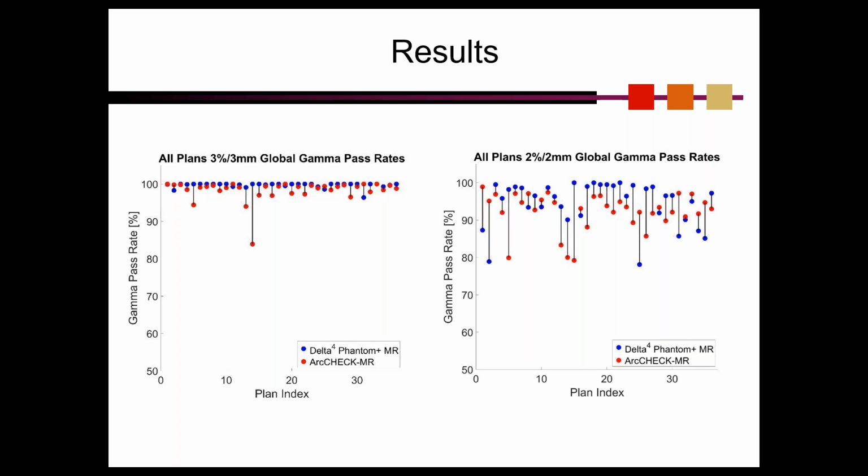There's a couple of things I want to draw your attention to on these plots before we get ahead of ourselves and jump to any conclusions. The first is that we can see here, based on the 3% 3mm plot on the left, that both devices involve similar measurement results for all 36 plans investigated.